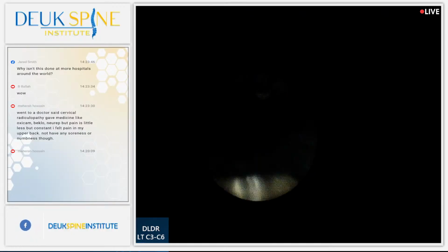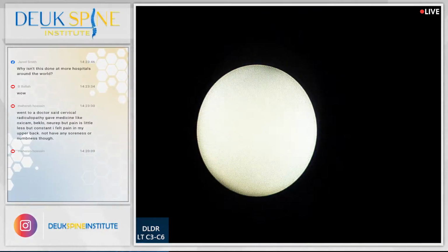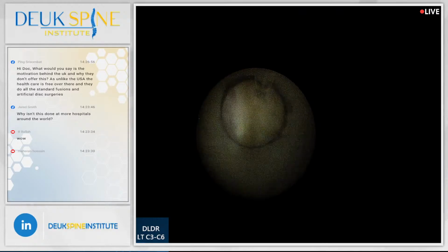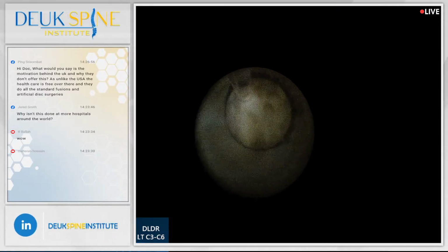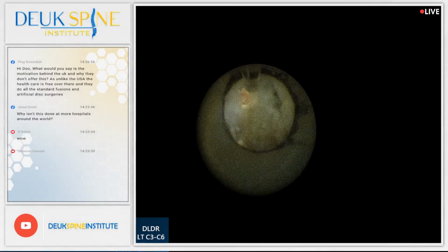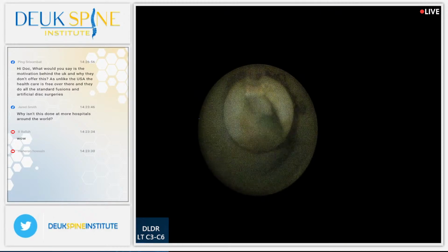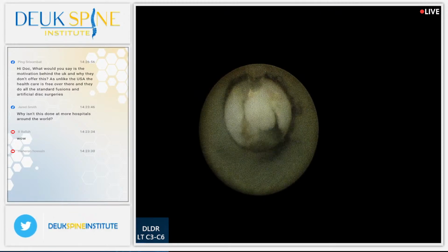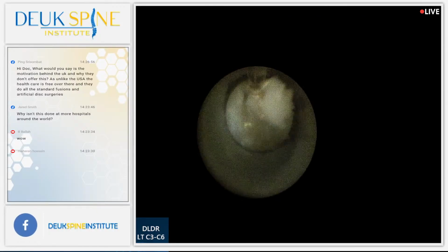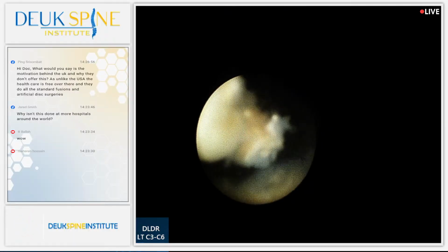You have the wrong diagnosis. Like I said, radiculopathy goes down your arm. It's not in your spine. I can already tell you have the wrong diagnosis, just what I was telling you earlier. You need the right diagnosis. It's no joke. 99% of doctors give you the wrong diagnosis. Who's kicking my leg? I just put a towel in. All right, we're almost done. I got literally 3 minutes left.